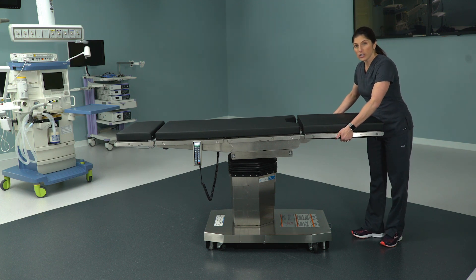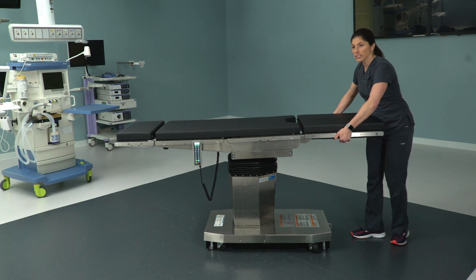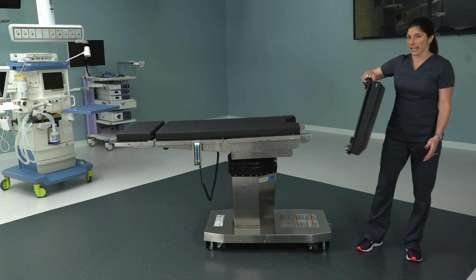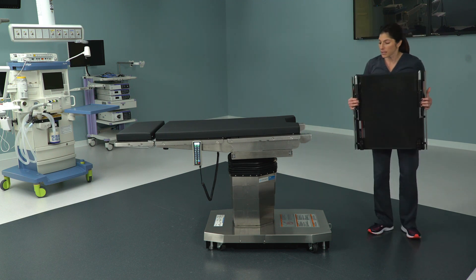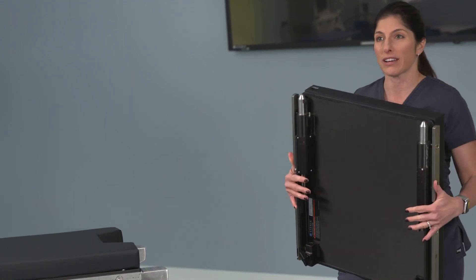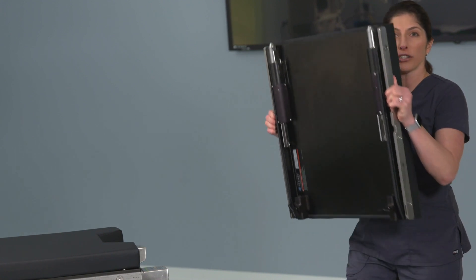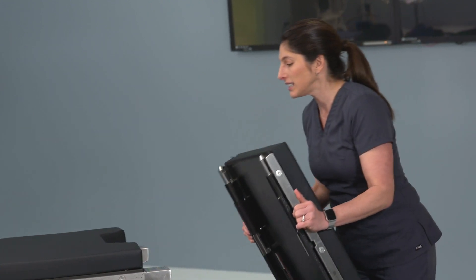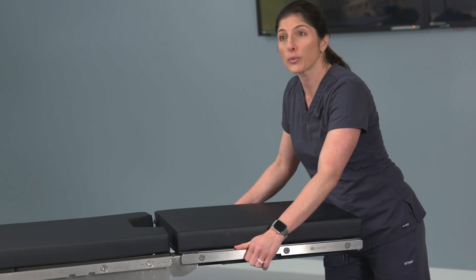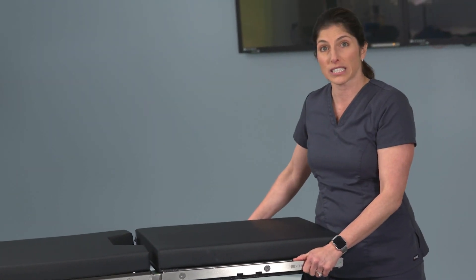If you take your hands right in the middle of this section of the bed, pull out on the levers, and then pull — the leg section is removable and very light, as you can see. Something to note when you go to place this back into the leg receptacles: you don't actually have to pull these levers out to do it. To make it easier, grab the leg section wherever is easiest for you and plug it right in.